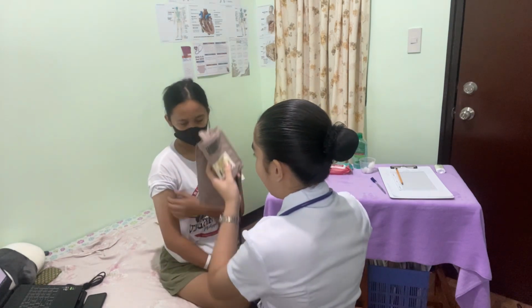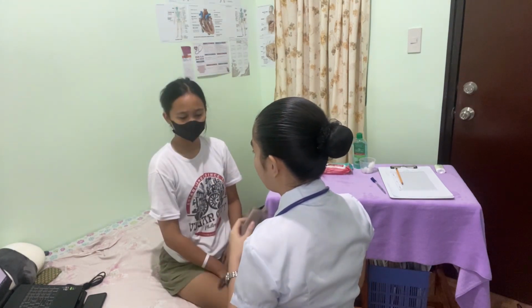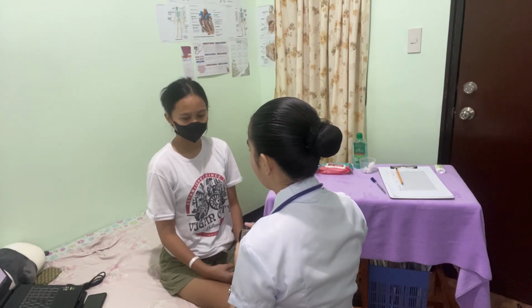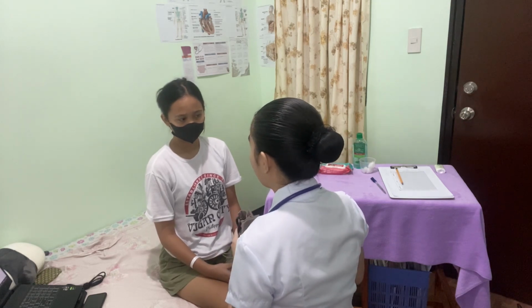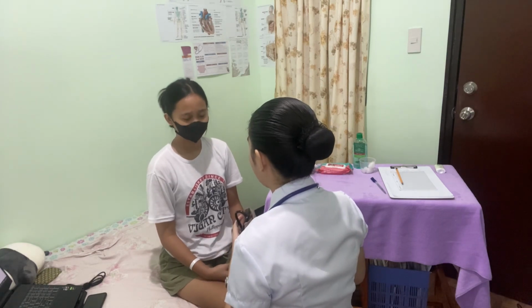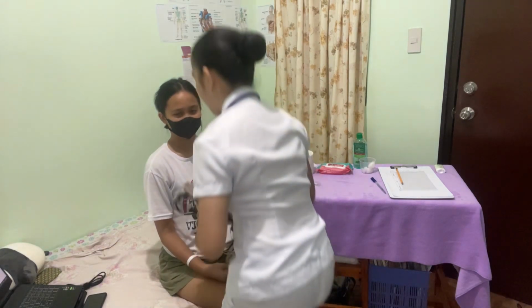So, ma'am, I have got your blood pressure, and it is 110/70 millimeters of mercury. Okay, and it is within the normal range. Thank you so much, ma'am, for your cooperation.